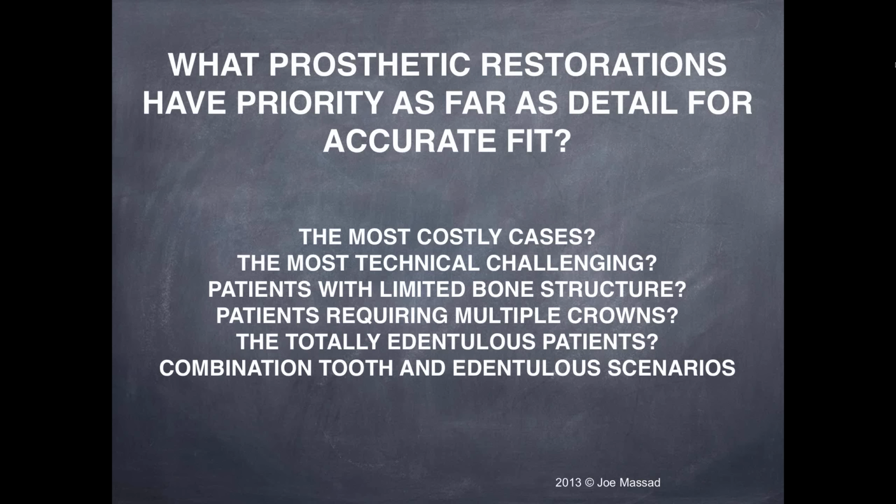How about combination tooth and edentulous scenarios? Anytime we have free-end saddles or even combination implant and edentulism, we're going to be making any type of detachable prosthesis. It's extremely important that we have accurate models for this.